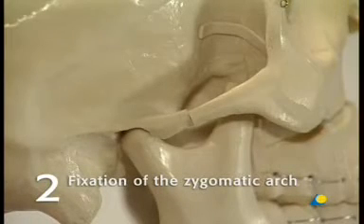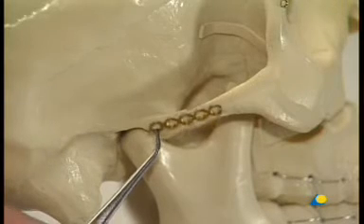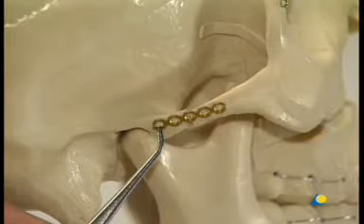Fixation of the zygomatic arch. The next step is fixation of the zygomatic arch, which is essential to establish the correct anterior-posterior projection and the width of the face. A straight 5-hole 1.5 adaptation plate is used for this simple fracture. However, the zygomatic arch is often comminuted, which would require a longer plate. Due to the anatomical form of the arch, pre-bending of the plate is usually not necessary.